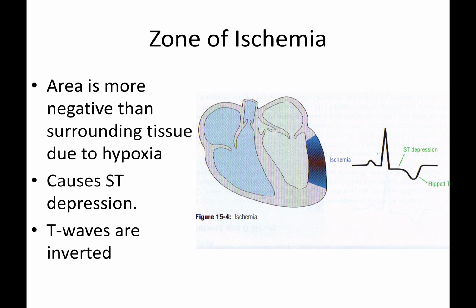So, breaking these down, looking at them in great detail. We have ischemia, and so this is number one. And yes, I realize I just earlier said that we're grouping these together, but I want to take a little bit of time and pick them apart for concept purposes. Zone 1 is ischemia, so it's the earliest stages. And yes, I know my handwriting's awful, I apologize.